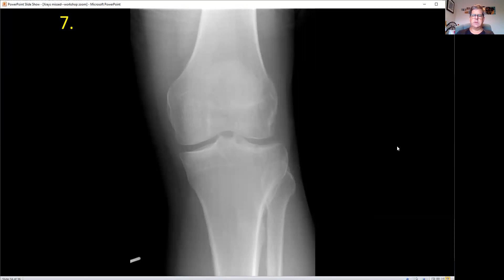Number seven. This gentleman had a fall and this was also missed. He has pain in his knee. His patella looks okay, but you can see a break in the cortex that goes down through here — it's a tibial plateau fracture. The distance on each side of the plateau should be even; this side has dropped down slightly, which is why it's easy to miss. The patient did have blood in the joint and needed operative care to hold this back in position.